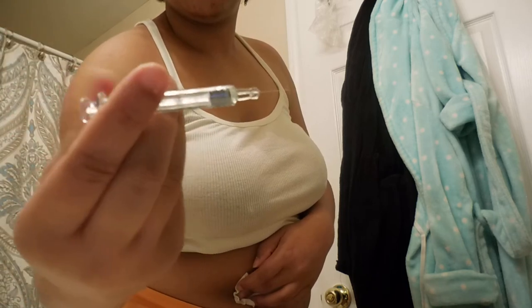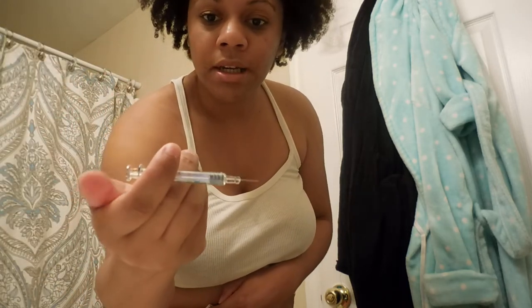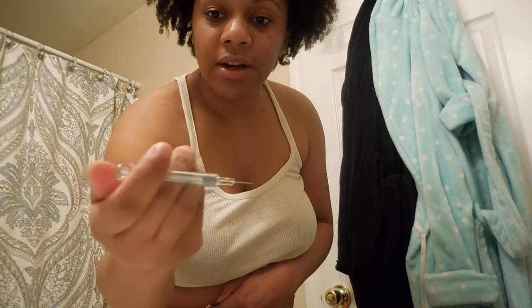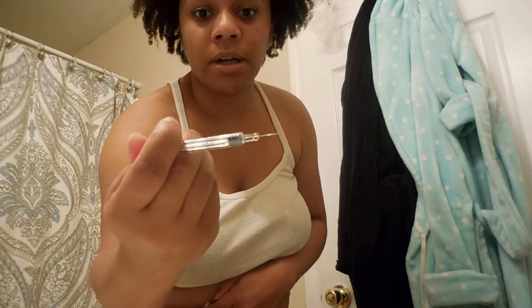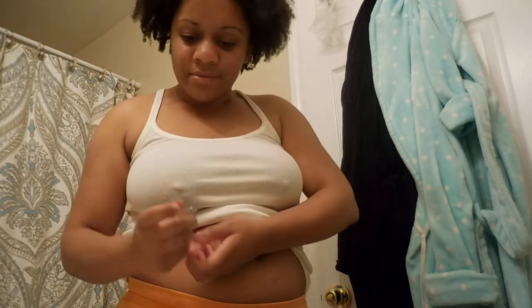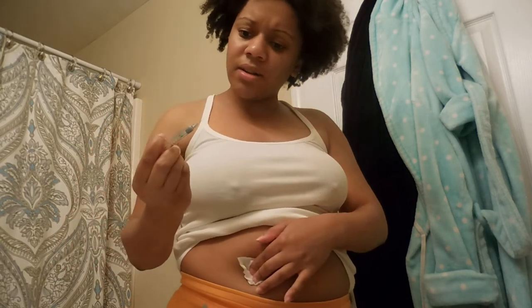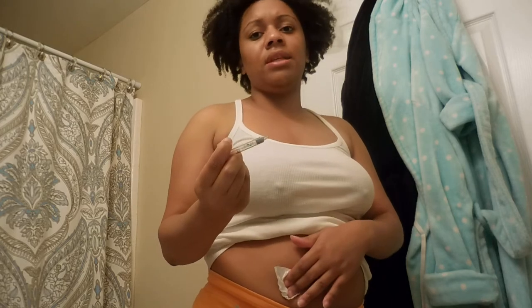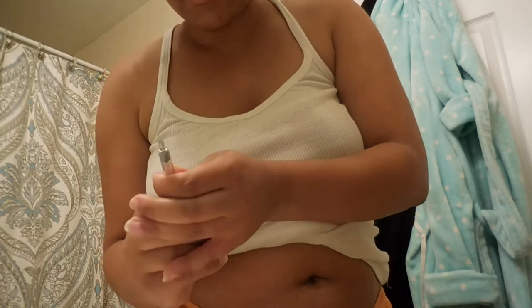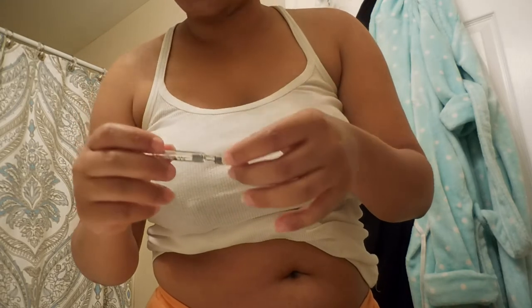So what I do to secure it is: once you hit it, you push it in your stomach, then take it out, and you'll actually be able to push it hard and that pushes the safety latch on. This one doesn't have a safety thing on it — that sucks. So do not do this around kids. You're never supposed to recap needles, but I don't have anything to put it in right now.